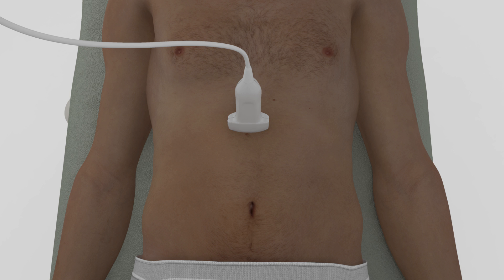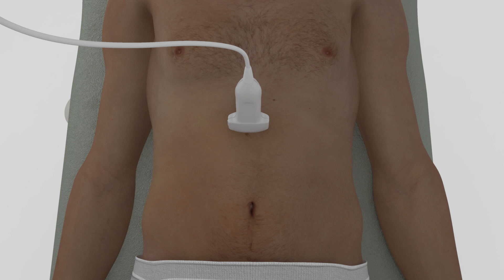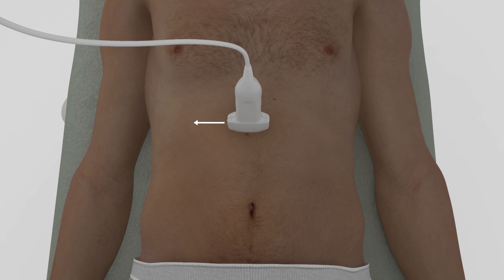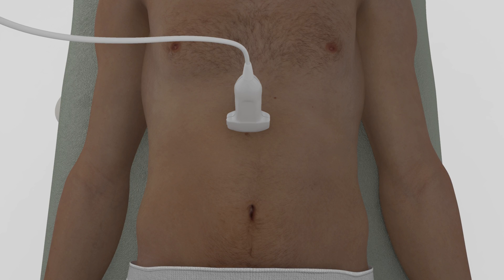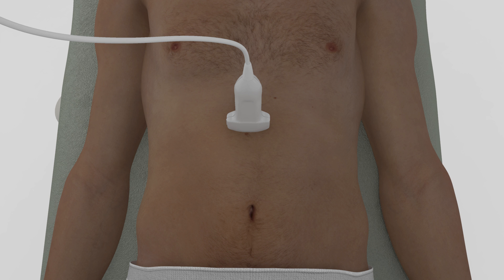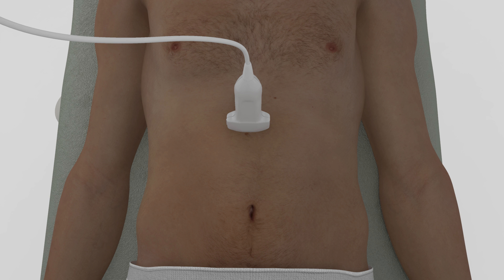First, bring up a view of the abdominal aorta in the transverse plane. Orient the probe so that the probe marker is pointing toward the patient's right. Begin scanning just below the xiphoid process and continue scanning inferiorly to approximately the level of the umbilicus. Keep in mind that the proximal abdominal aorta is deeper than the distal abdominal aorta, so adjust the depth and focus position accordingly.